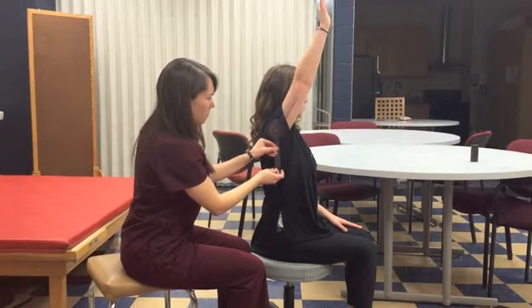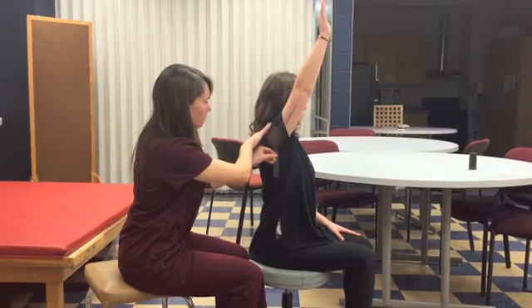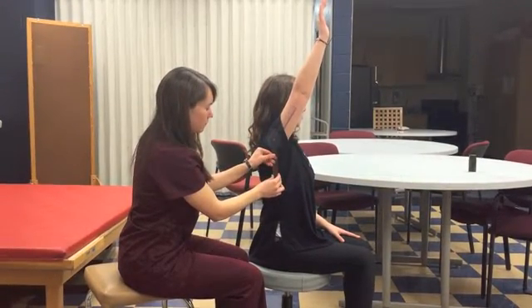At a complete range of motion, the therapist should notice a firm end-feel due to the ligaments of the shoulder being stretched. Rachel's full range of motion for shoulder flexion is 150 degrees.